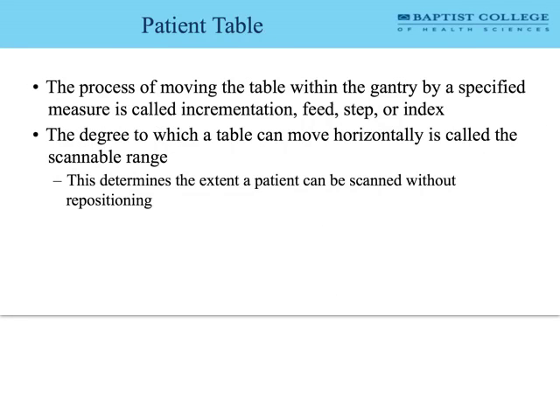Let's talk a little bit about the patient table. And she doesn't quite give us enough on this. Let me hit pause for just a sec on patient table, and talk a little bit about these detector electronics.